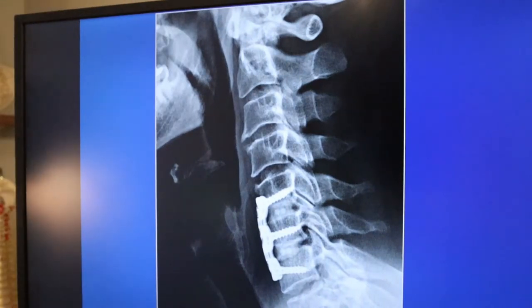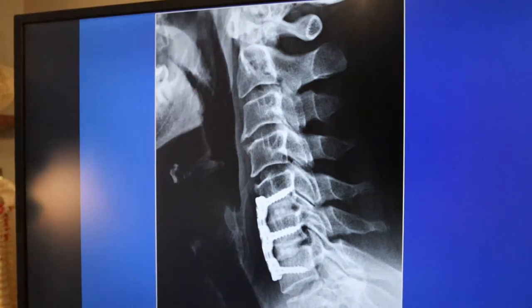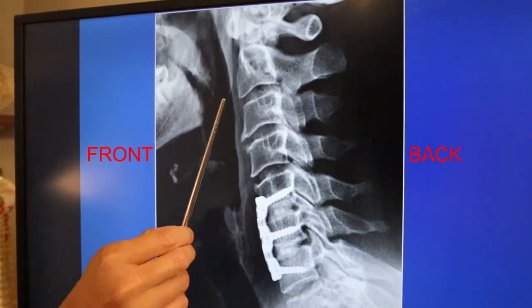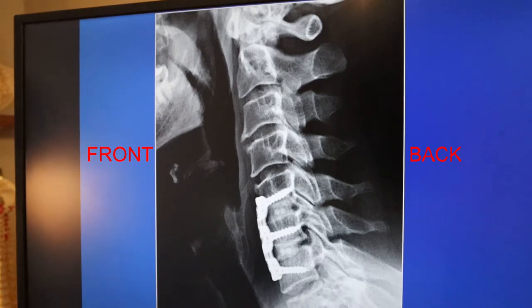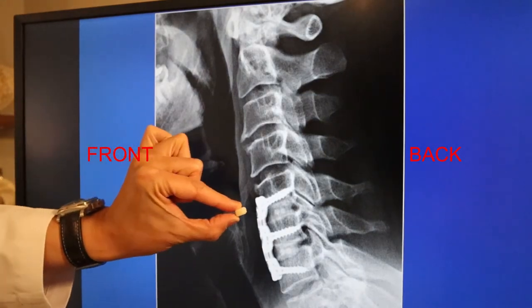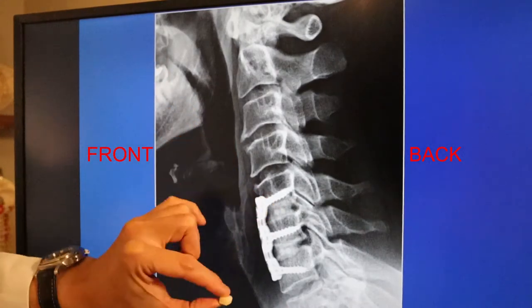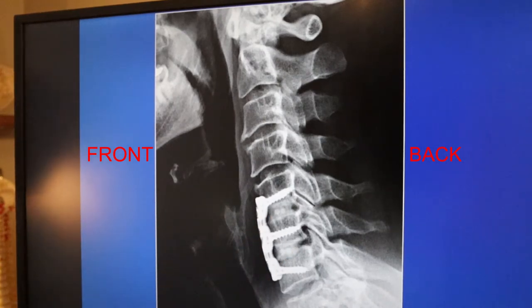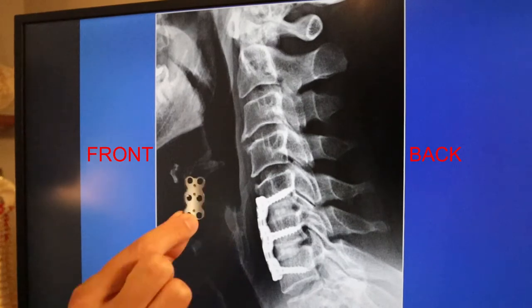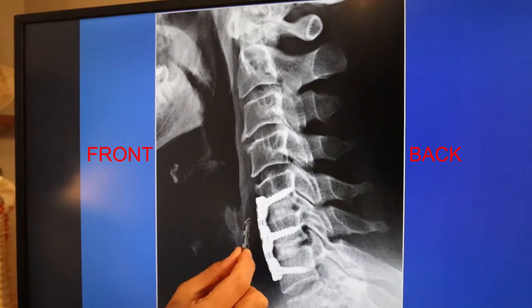Here's a good example of one of my patients who had a two-level anterior cervical fusion. Looking from the side — this is the front of the neck, this is the patient's jaw — C2, C3, C4, C5, C6, C7. This patient had C5-6 and C6-7 fused. I used bone in this instance, placed here to keep the C5-6 and C6-7 disc spaces open and also to aid in fusion. And this is the side view of the anterior cervical plate with the screws driven into the bone.